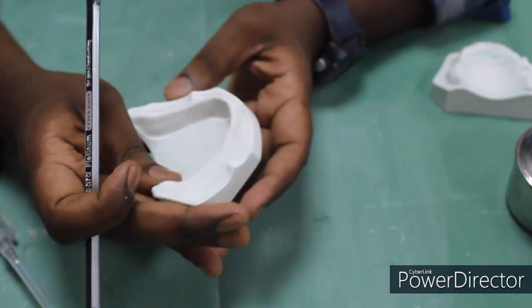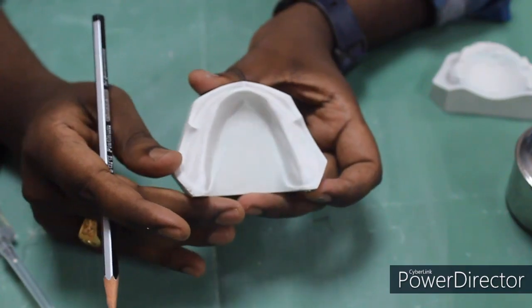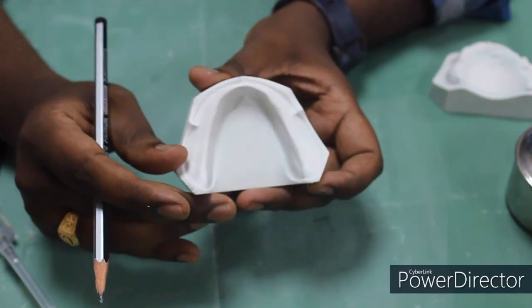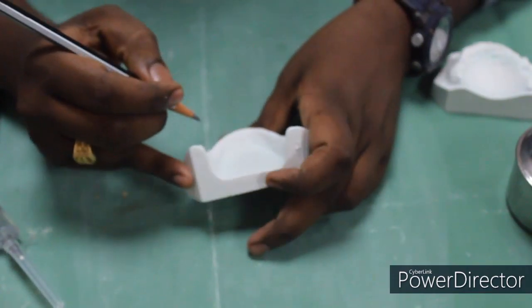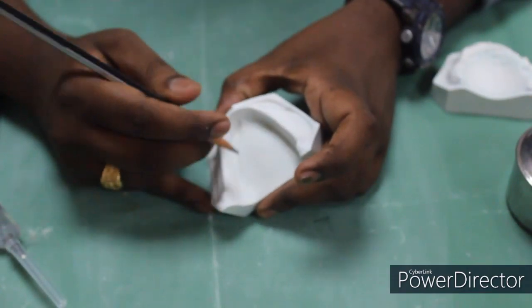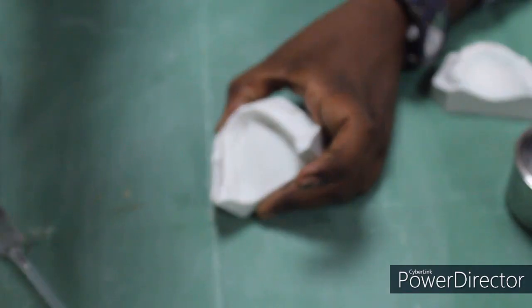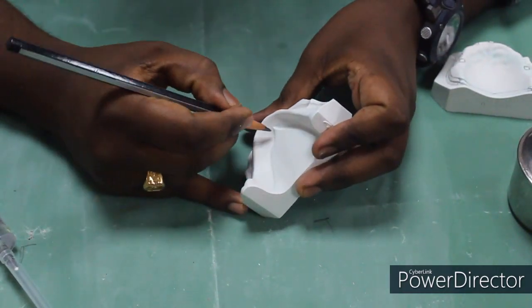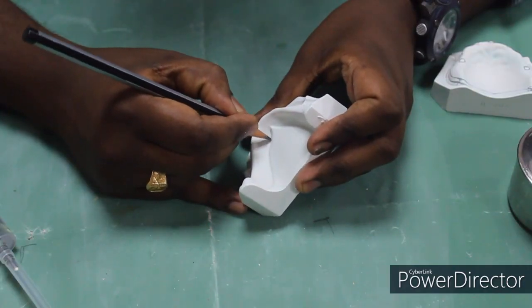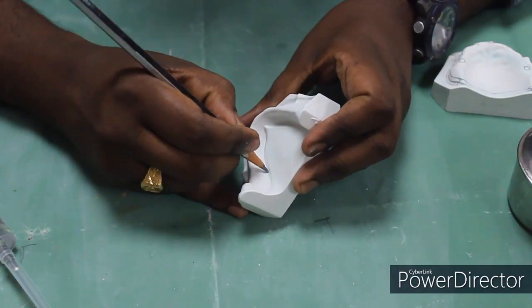This is the primary cast made from the primary impression. Here we are going to see, first we have to highlight the depth of sulcus as we did for the maxillary cast. We are going to do the same here in the mandibular cast. In the lingual aspect, you have to first highlight this depth of sulcus.